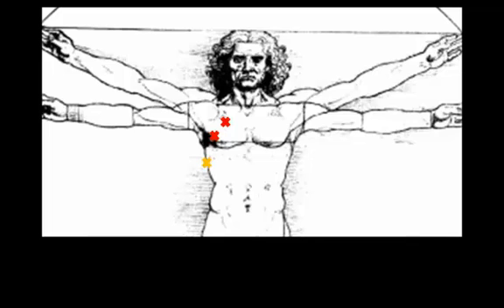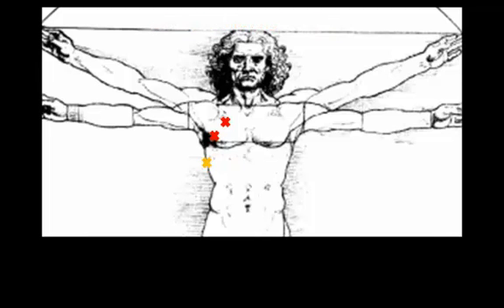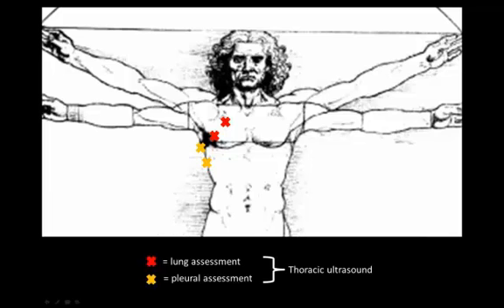Moving on to pleural ultrasound: the third view is the diaphragm and the costophrenic angle, looking for pleural effusion or consolidation of the lung. The fourth view is the PLAPS point, which is effectively an extremely dependent region of the lung where you will find the highest sensitivity for detection of consolidation and pleural fluid. The combination of these points represents a full thoracic ultrasound assessment.